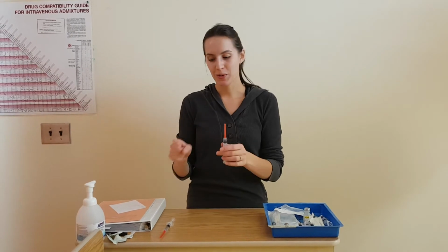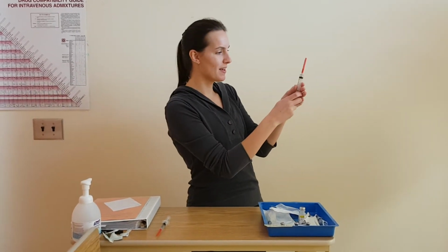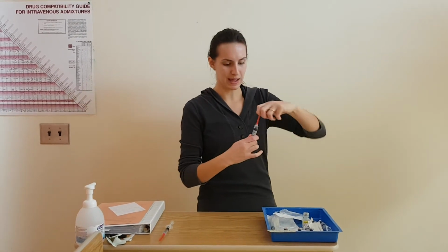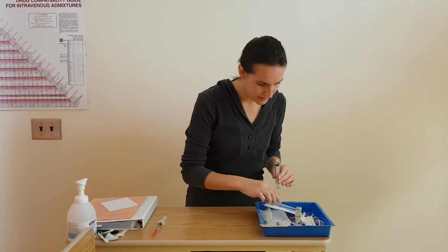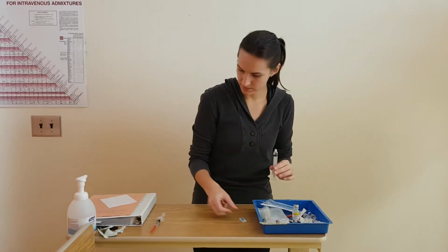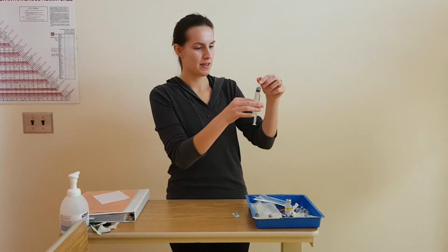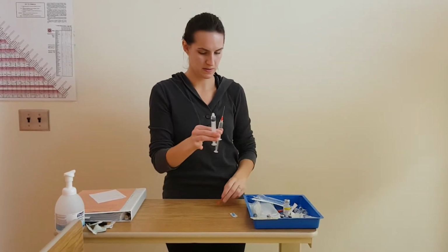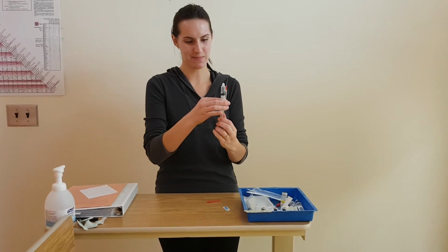Now at this point, I'm going to inject my medication into my syringe. So I'm going to pull back the plunger. I would remove this needle and discard this in the sharps bin. Also, the potential hazards that I would be looking for are nausea, vomiting, diarrhea, and abdominal pain. So I will take this off for that before and after. Actually, sorry, I need to pull this back quite a bit more.